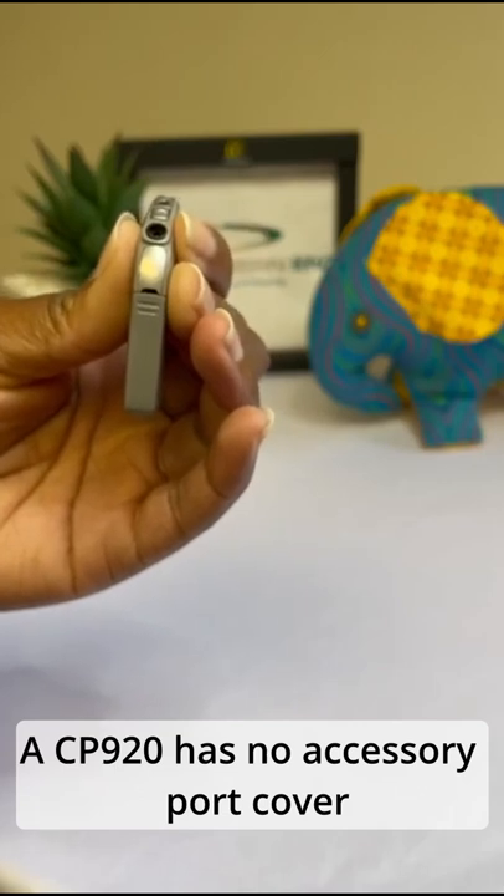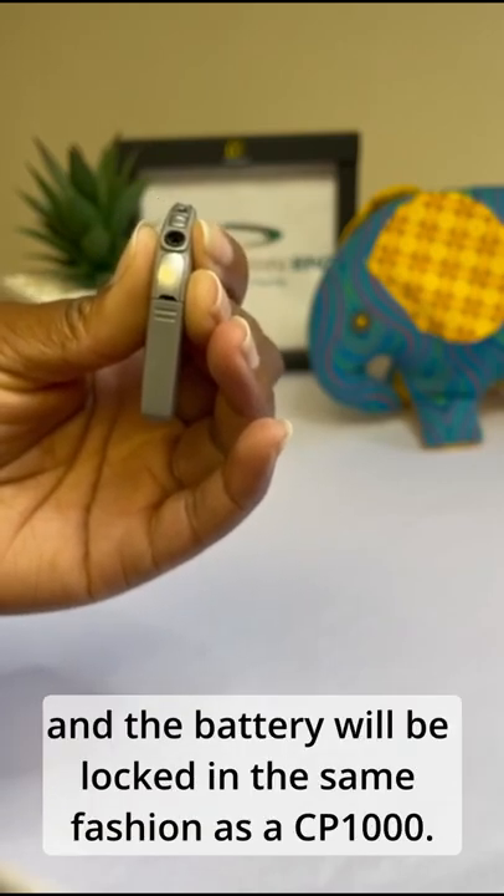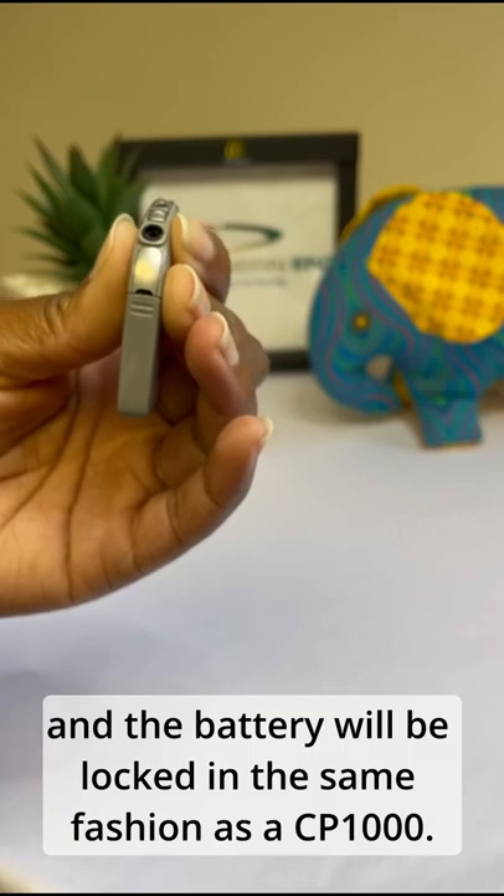A CP920 has no accessory port cover and the battery will be locked in the same fashion as a CP1000.